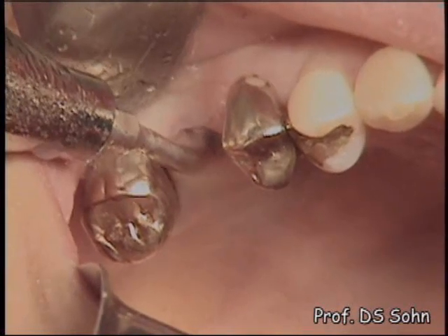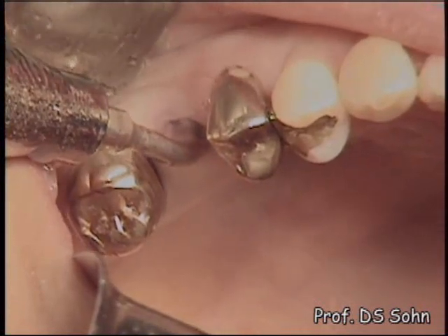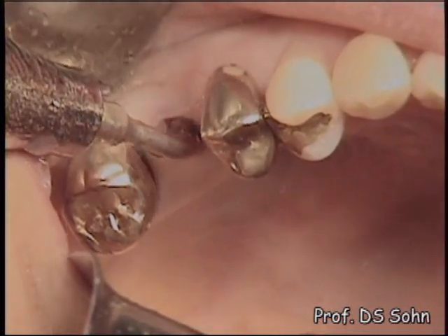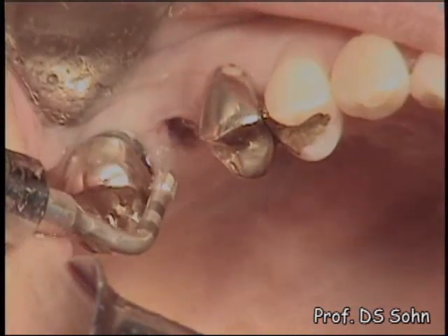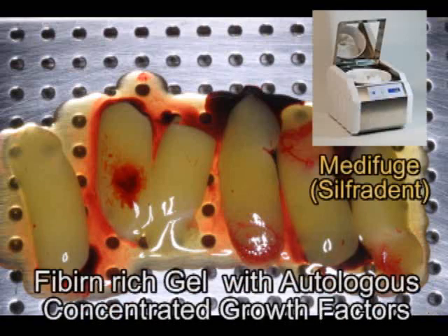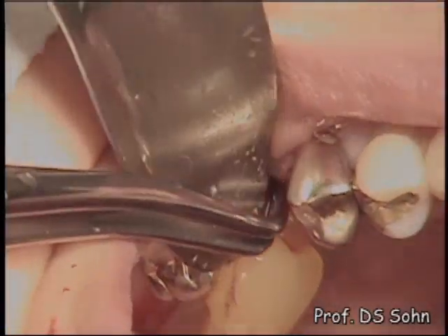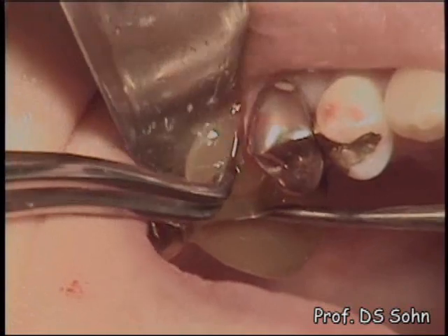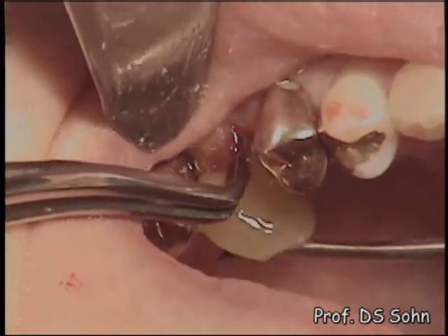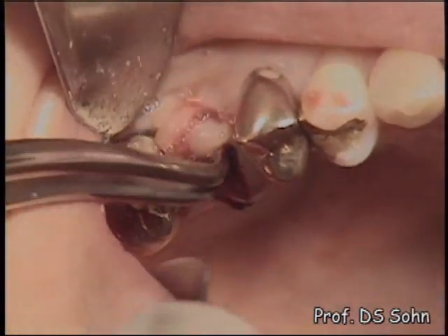The HP step is the final osteotomy tip to accommodate a 3.7 to 4.2mm wide tapered designed implant with good initial stability. Autologous concentrated growth factors were prepared using a special centrifuge, Medifuge. These fibrin-rich gels were inserted into the compartment under the elevated sinus mucosa in order to accelerate new bone formation in the sinus.